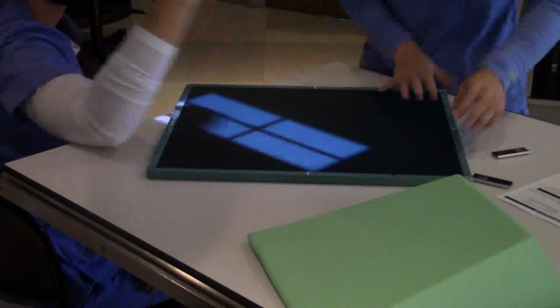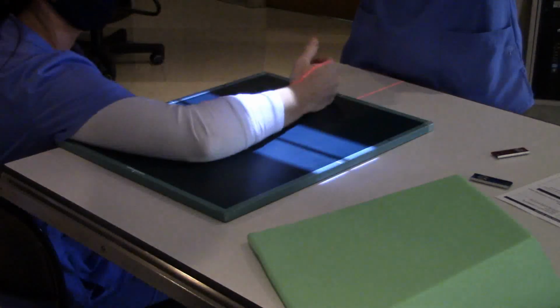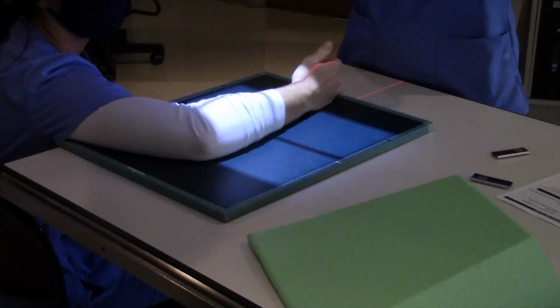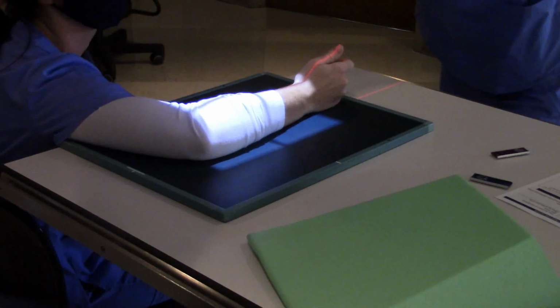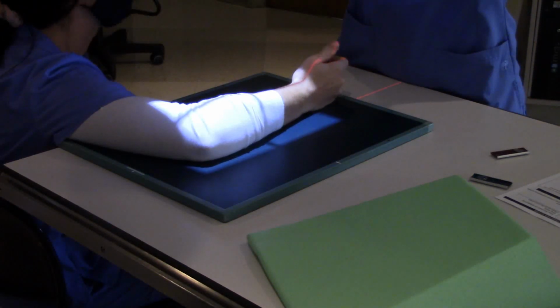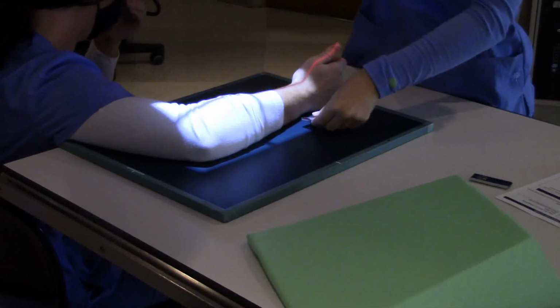All right, now for our next image. Lateral aspect. Oh yeah, that's going to fit on there with room to spare. There you go. You want to open up, you don't want to clip off any of that olecranon.